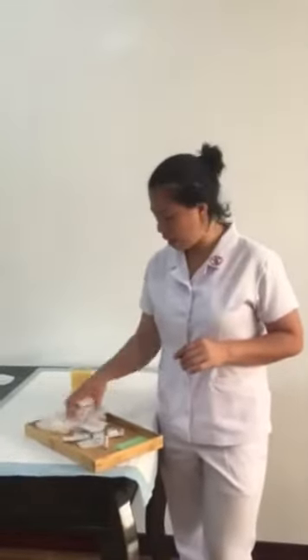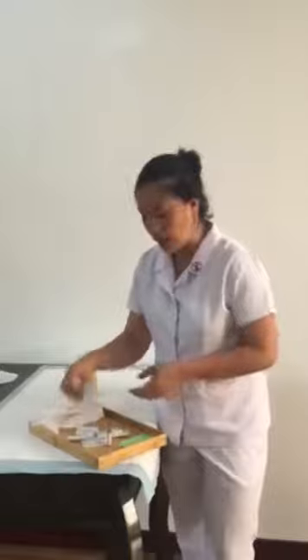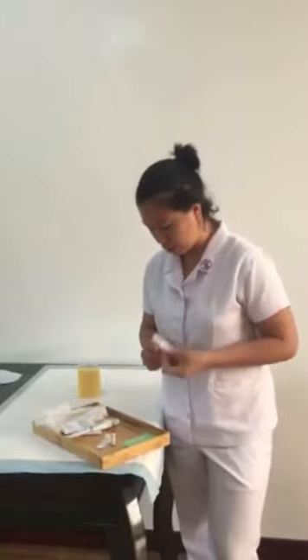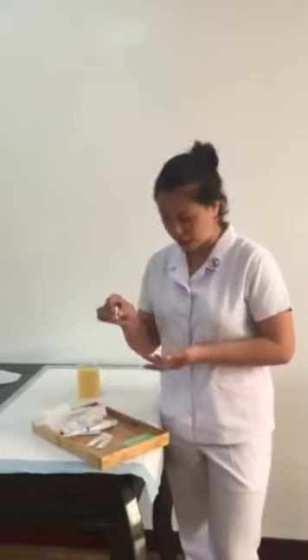I'll be preparing my equipment to have better access during the administration of the drug and save time and effort. Now I'll be preparing my clean gloves, alcohol swab, my syringe, and also ideally we need to have the filtered needle, but I'll be using the regular one, and the medication ticket.